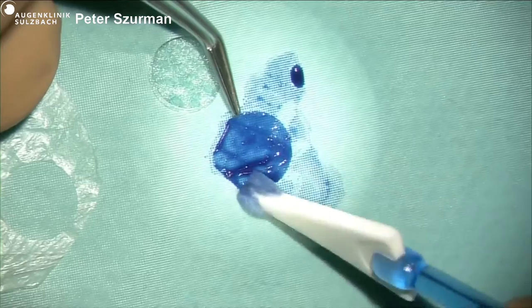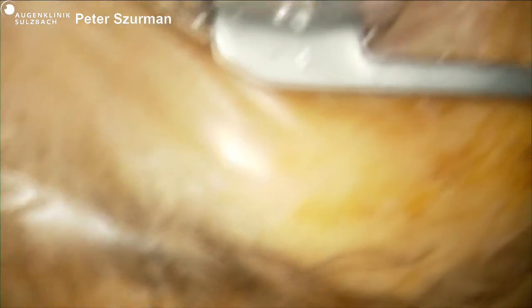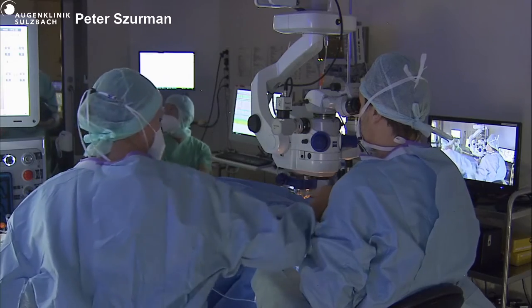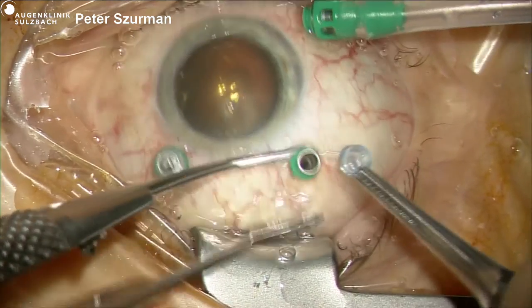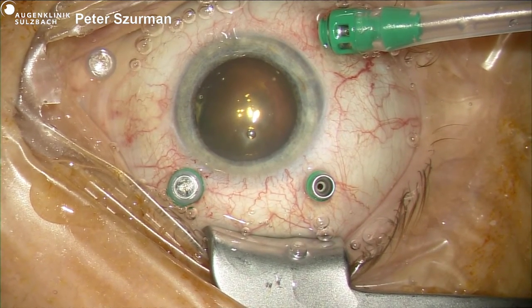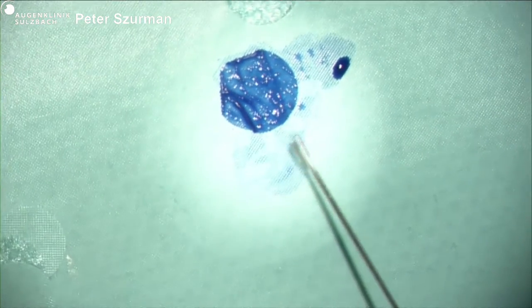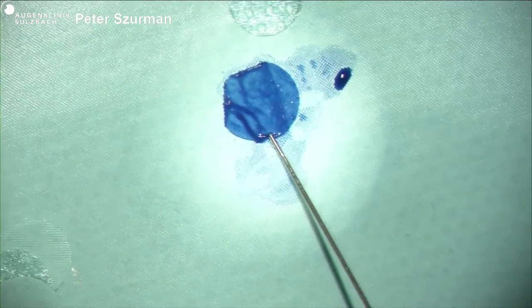So you see, it's quite large. I agree with you. I use the same staining because otherwise you lose control of the membrane, while inside you can perfectly visualize where it is, if it moves and what you do. I'm also curious about your technique to introduce it. Yes, indeed, this is the important step. The small trick is that we use 23-gauge trocars, but we insert it with a 27-gauge forceps.